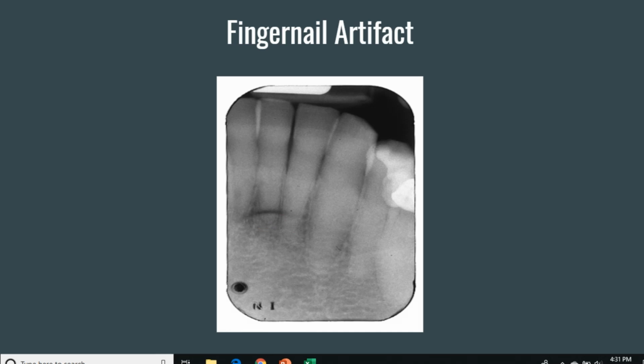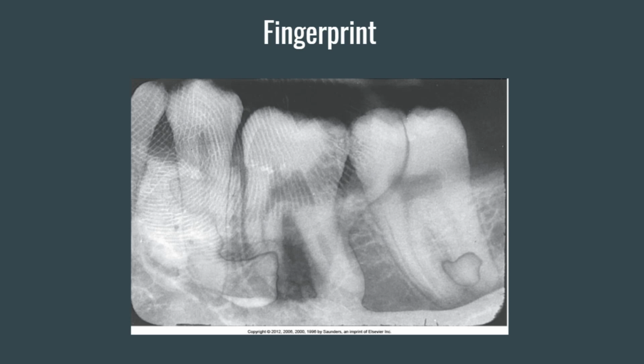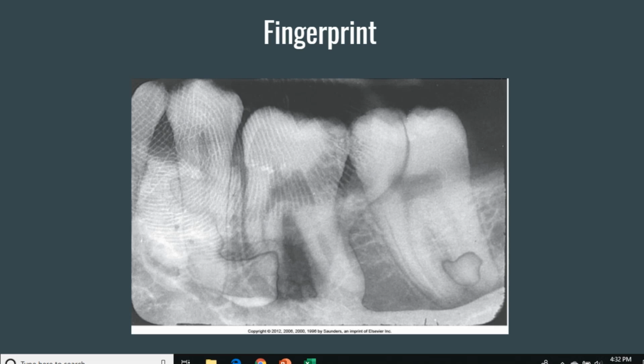This is considered rough handling. So gently handle the films, and you only want to touch the films by the edges only. If you touch it in the middle of the film, you can cause a fingerprint. So in this area, again, I'll remove the markings, but in this area, if you look closely, you can see the pattern of a fingerprint.